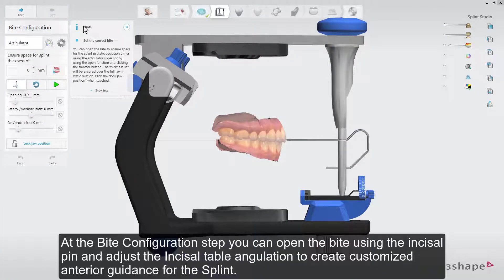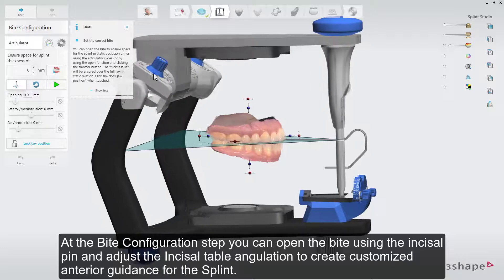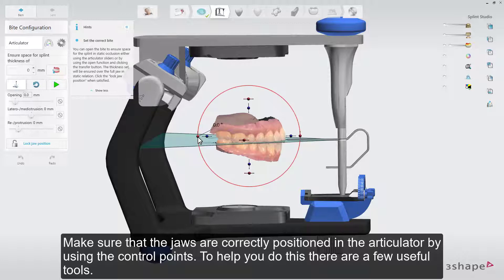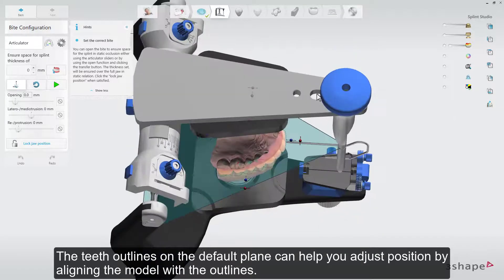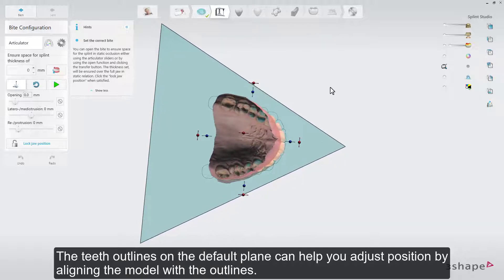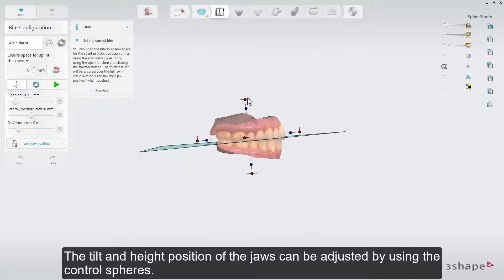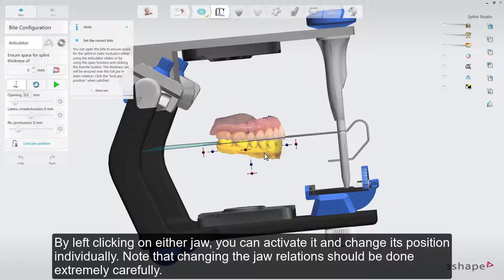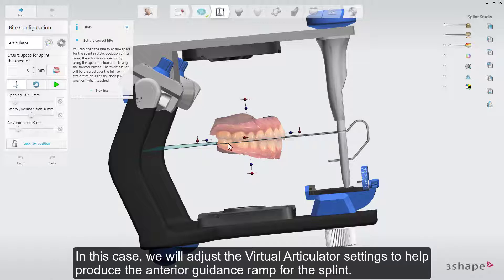At the bite configuration step, you can open the bite using the incisal pin and adjust the incisal table angulation to create customized anterior guidance for the splint. Make sure that the jaws are correctly positioned in the articulator by using the control points. The teeth outlines on the default plane can help you adjust position by aligning the model with the outlines. The tilt and height position of the jaws can be adjusted using the control spheres. By left-clicking on either jaw, you can activate it and change its position individually. Note that changing the jaw relations should be done extremely carefully.